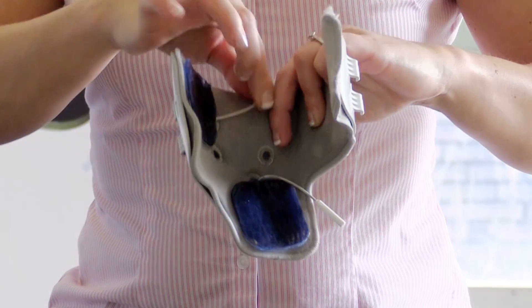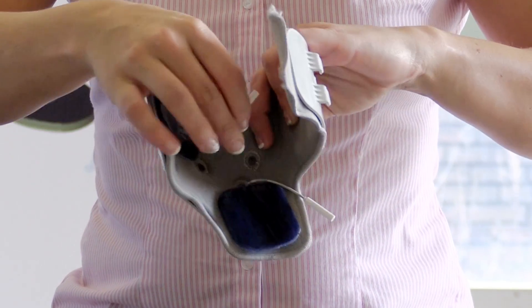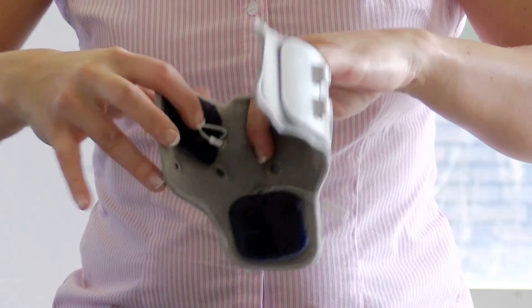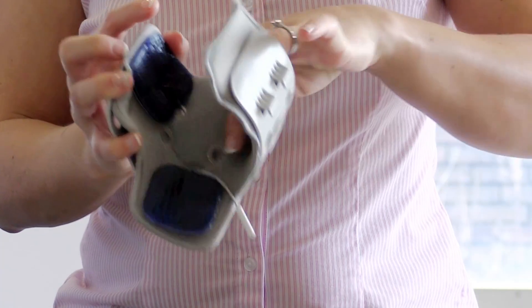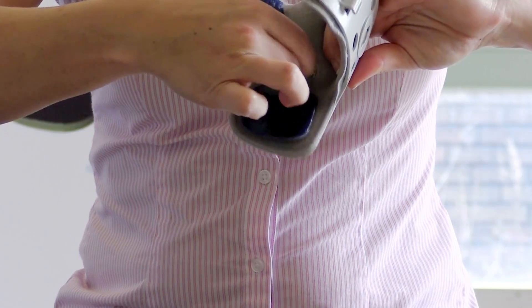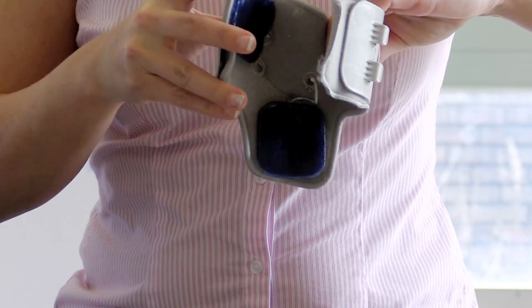Now you need to thread the lead to the electrode through the nearest hole on the leg cuff liner. Pass it through like so, then turn to the bottom one and thread it through the nearest hole in the same way.